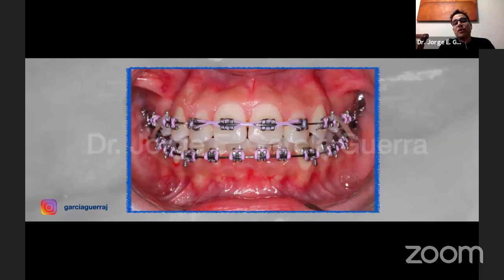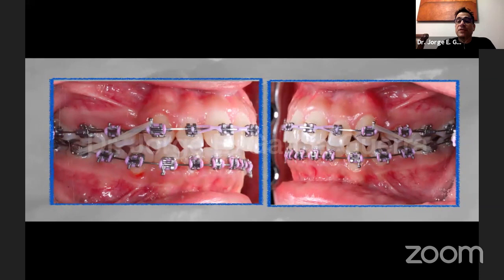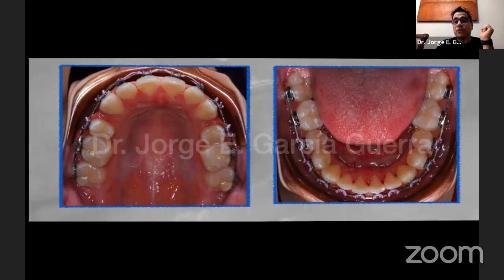So in this case, I decided to put some mini screws between the upper first molar and the upper second bicuspid, okay? We were closing spaces. We were using some class two elastics to help us with the closure. We're using some MBT brackets. That's why you can see that we have the laterals inverted. So we have a little spaces there, but as we're gonna close the space, I didn't want my incisors to retrocline. So we put these mini implants to help us with the space closure.